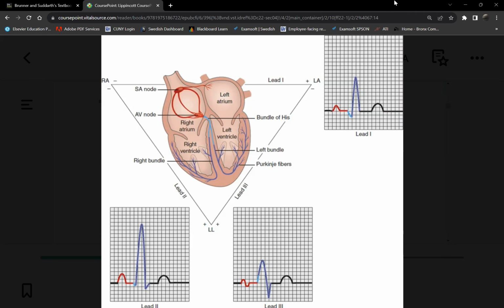Now, because of that, unlike the others, which only carry either a negative or positive charge, because it's positive and negative, that will give you 2 views. Okay, so they will interact with another lead, giving you an extra view.